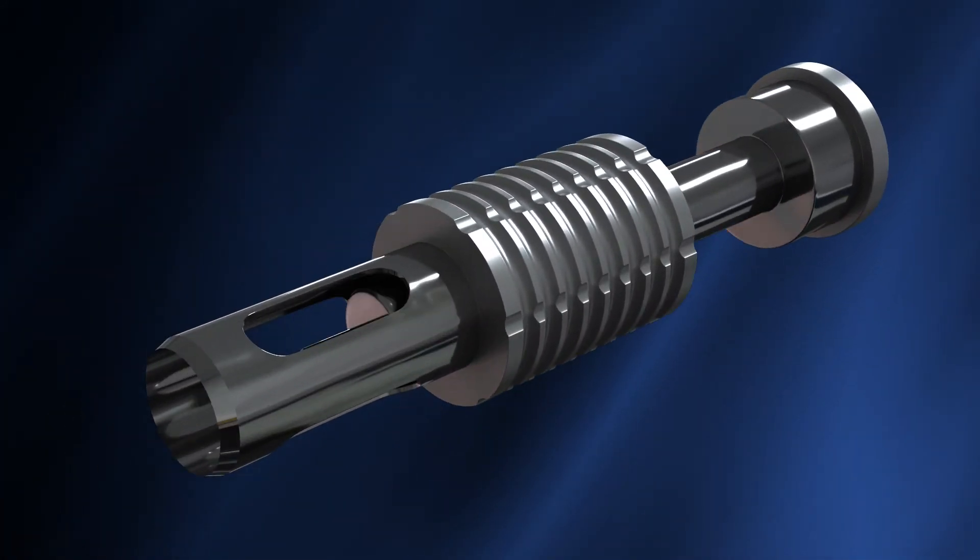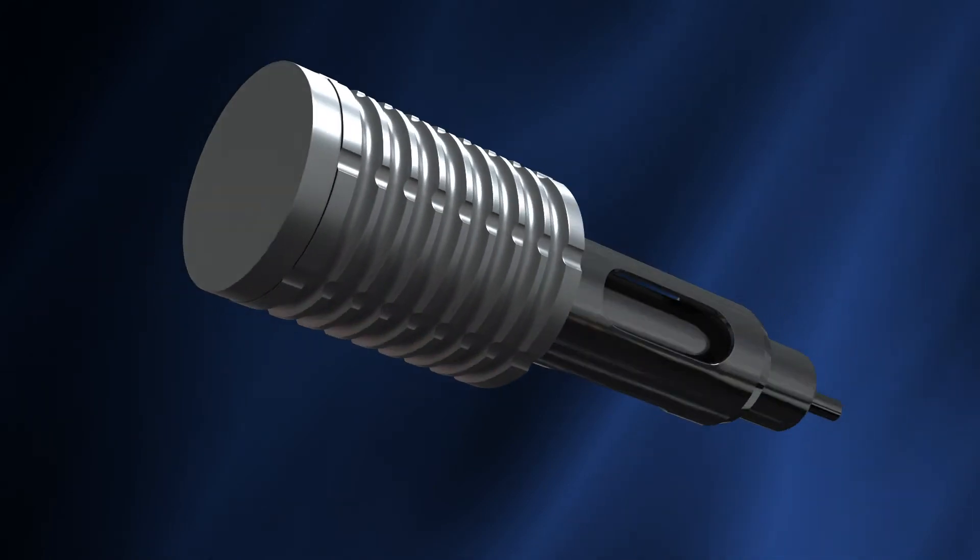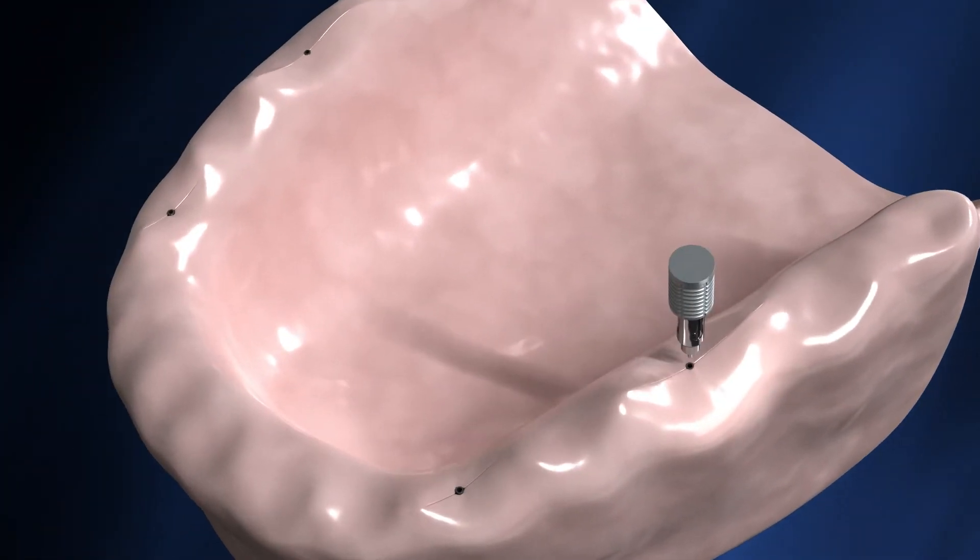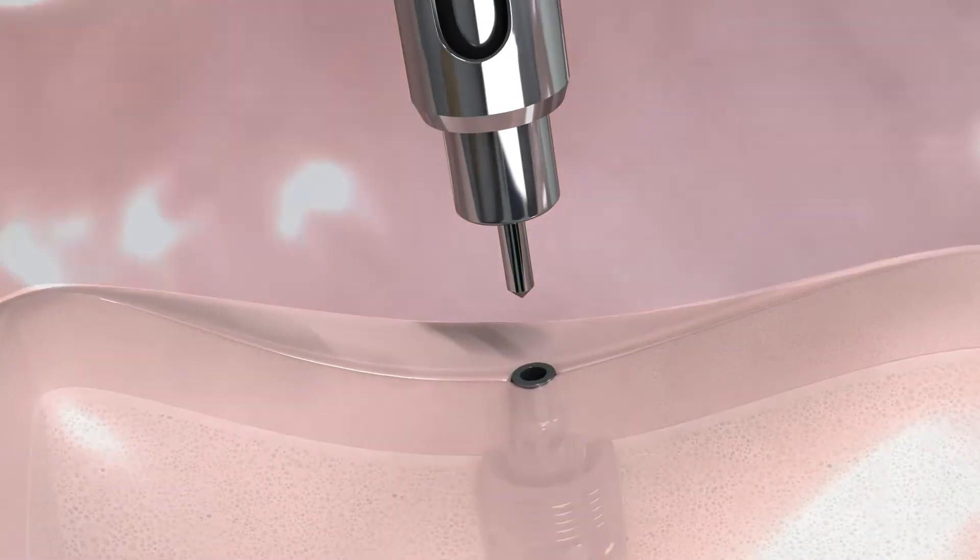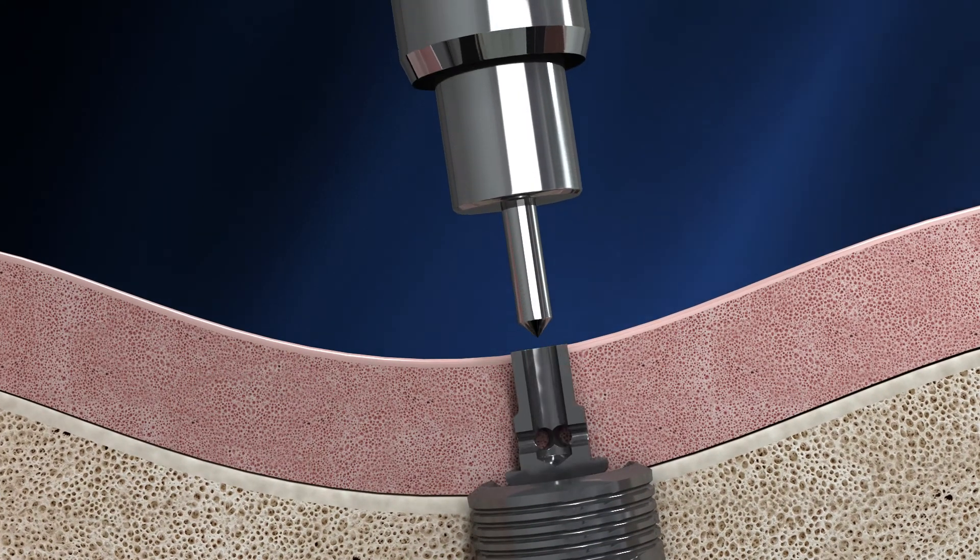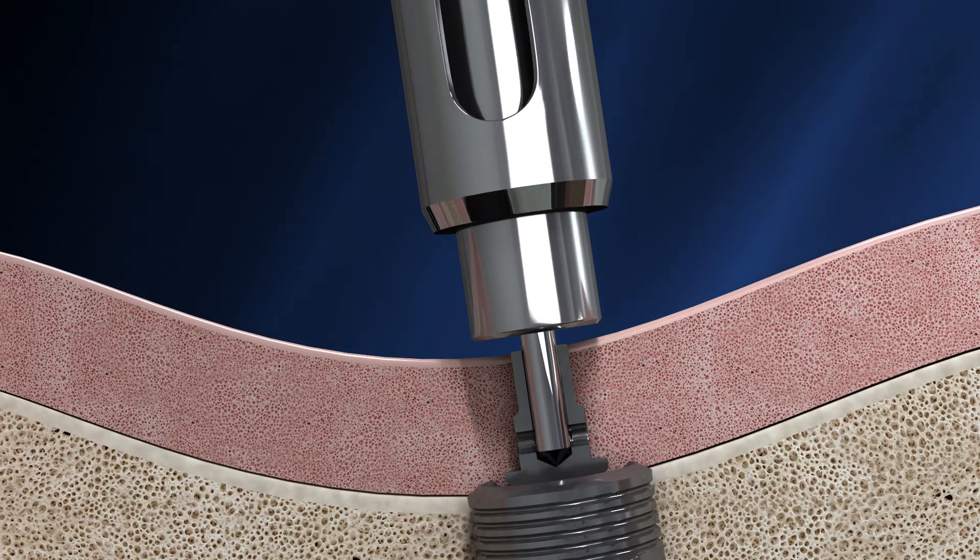Then, use the proprietary Pathfinder punch, exactly fitting the irrigation tunnel, to cut a precise amount of soft tissue in the right direction and angulation, all the way down to the implant platform.